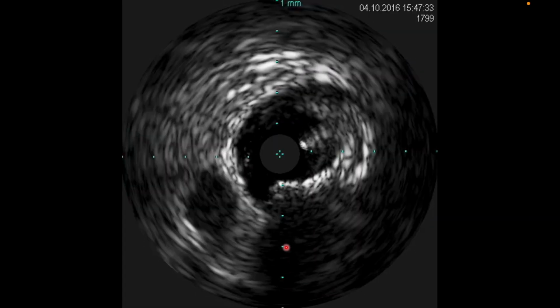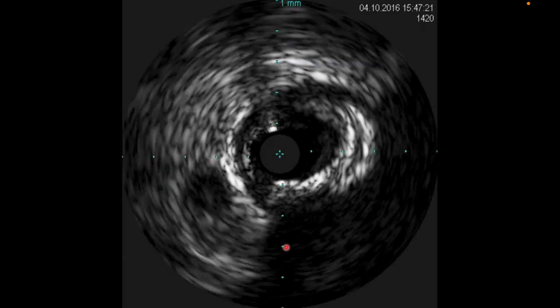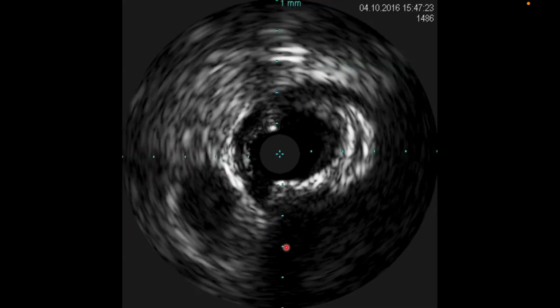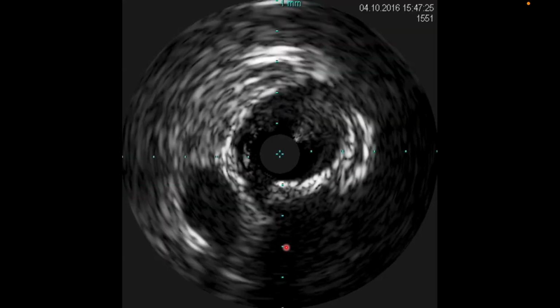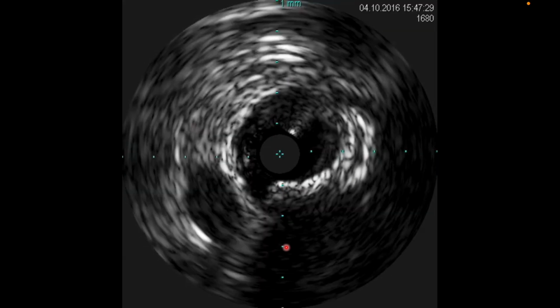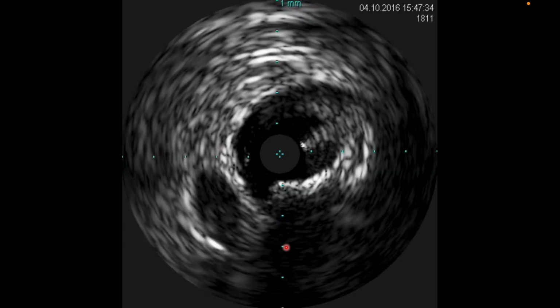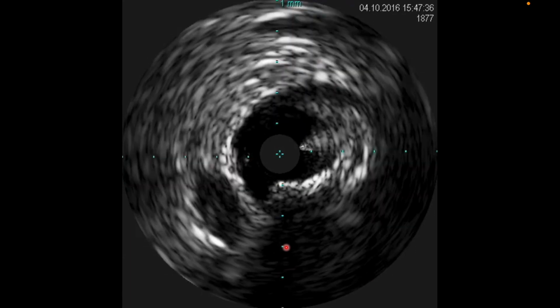Then in order to puncture that cap, with the help of this artifact, you point your wire towards that ambiguous proximal cap where the branch is, and then you push the wire in. We will see this in the CTO talk, but you can use these artifacts to your advantage to see the direction of the wire.